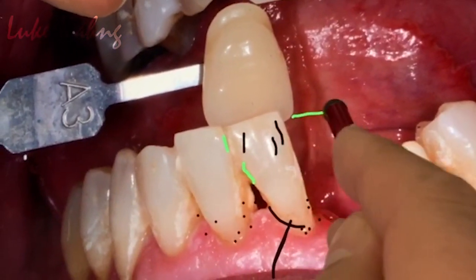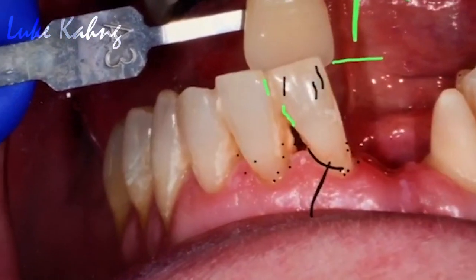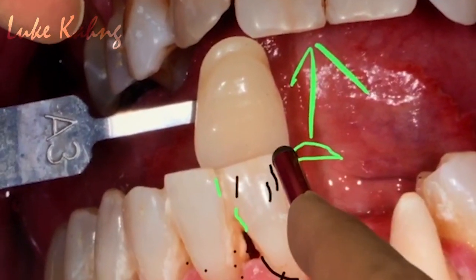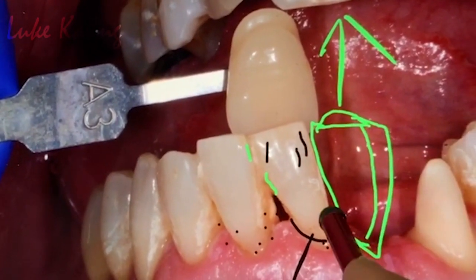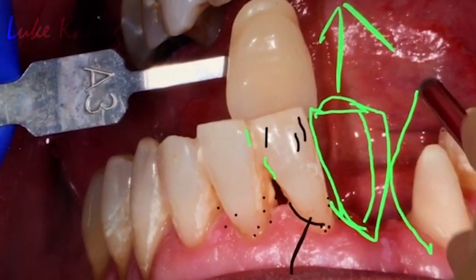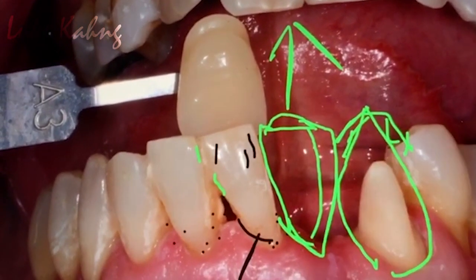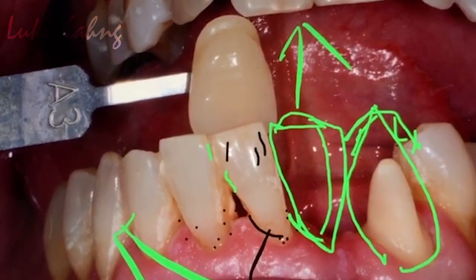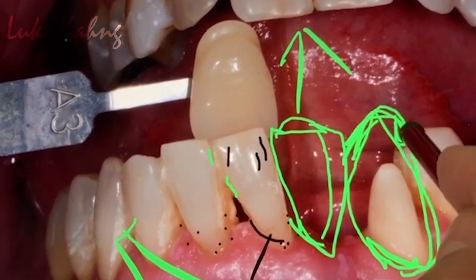So finally I made just like the other side, but I want to get the occlusion. So I make it a little bit bigger, but I'm trying to make the cantilever this much, and then canine, follow just like the adjacent teeth. Okay, so that one is our design for this.